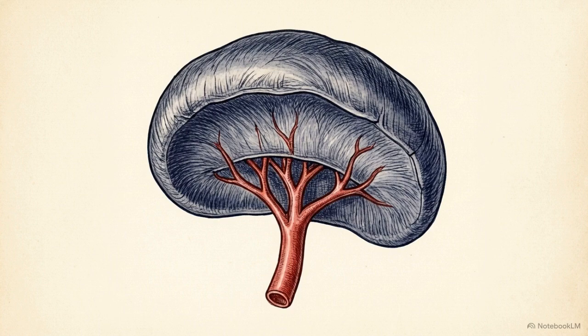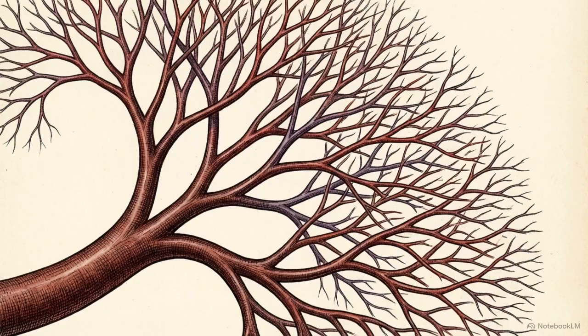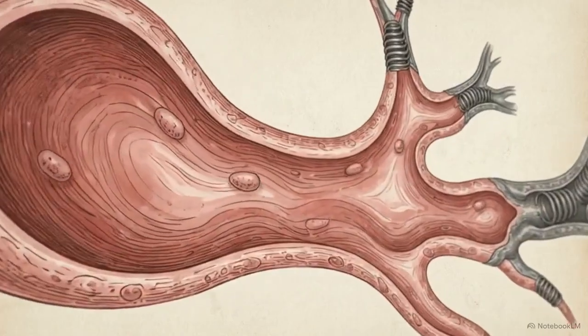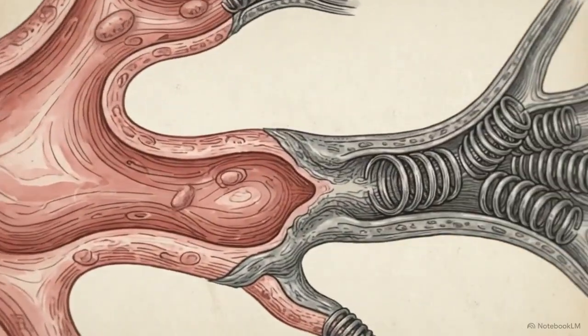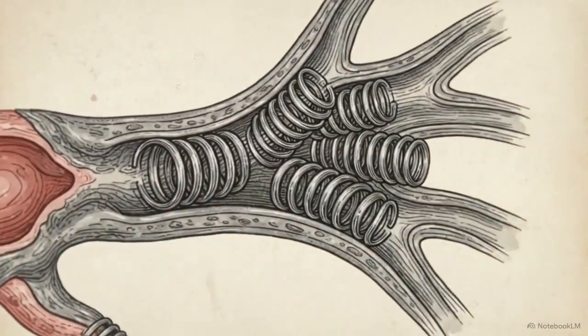If that same blunt trauma occurs in the spleen, the lack of a dual blood supply forces a completely different strategy. The spleen's deep, distal arteries do not have neighboring collateral vessels waiting to take over if the main supply is physically blocked. Deploying coils deeply into multiple distal branches within the spleen starves the tissue permanently, resulting in complete, irreversible infarction of the organ.